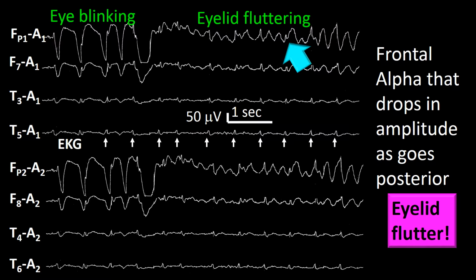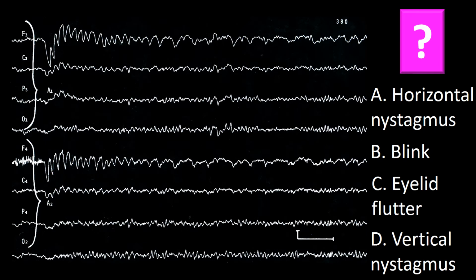You can appreciate that association pointed here by the arrow head. So the answer to this question is C.